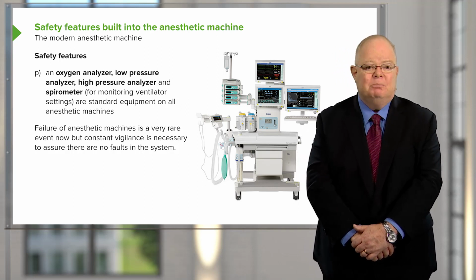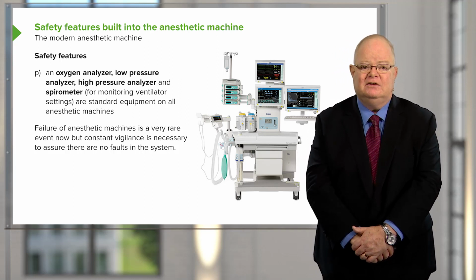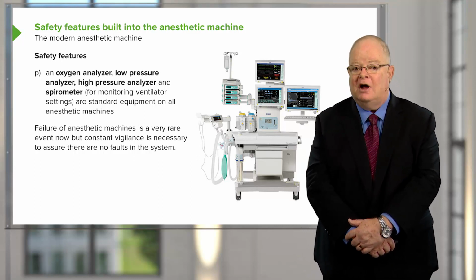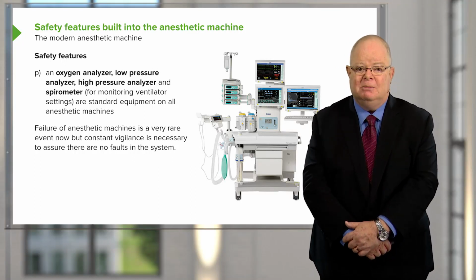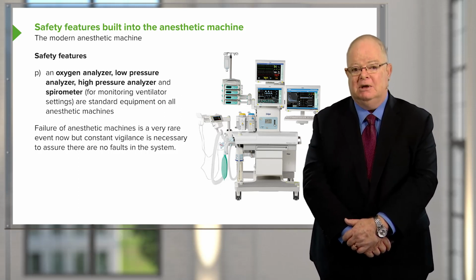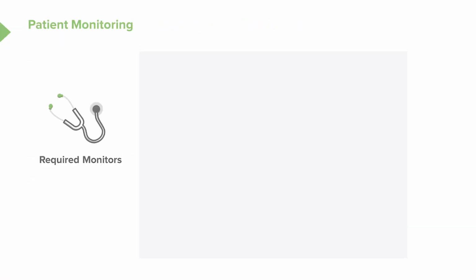On another machine, a brand new machine, the amount of desflurane set by the anesthesiologist was initially supplied properly by the machine, and then for some reason, suddenly it stopped providing the dose that had been set. There was a dramatic drop in the amount of desflurane, and only the fact that the anesthesiologist was paying attention saved the patient from waking up in the middle of surgery. Those machines are now being evaluated to determine if there's an underlying system problem that needs to be fixed.